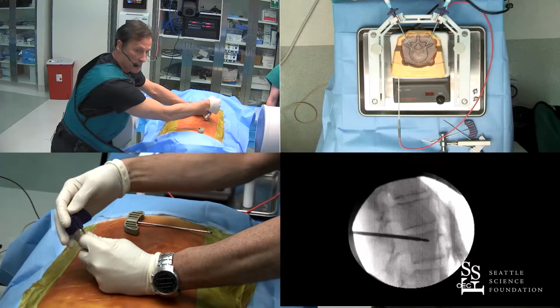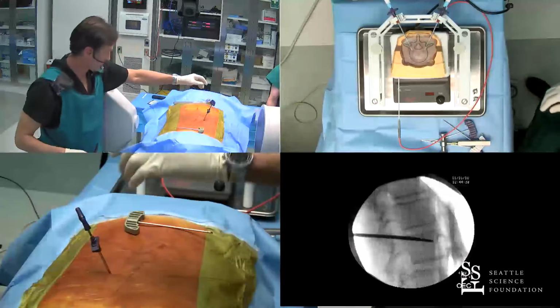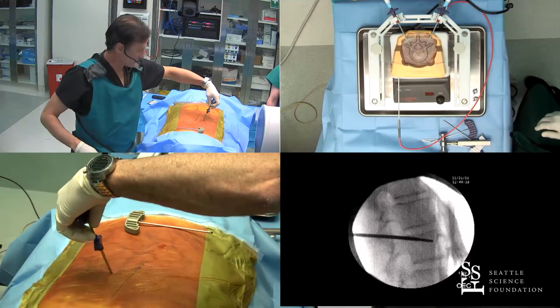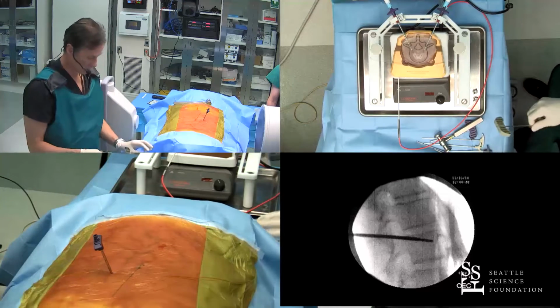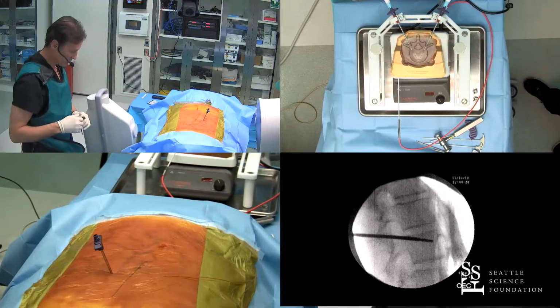Most of the time, people use live fluoro, but just to save radiation, I'm going to use intermittent fluoro. So within 3 to 5 millimeters of the anterior vertebral body, I'm going to come back around, and I'm going to use the same beveled needle on the other side. So we'll come back around to AP.